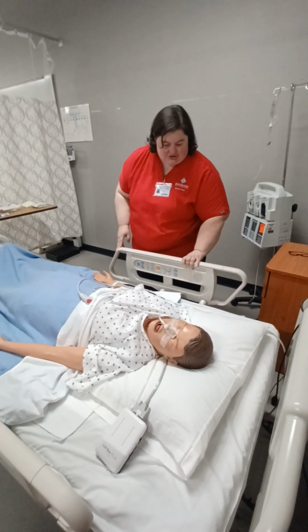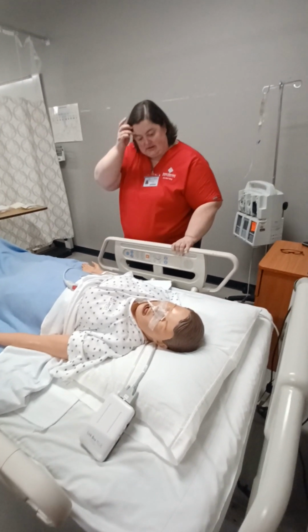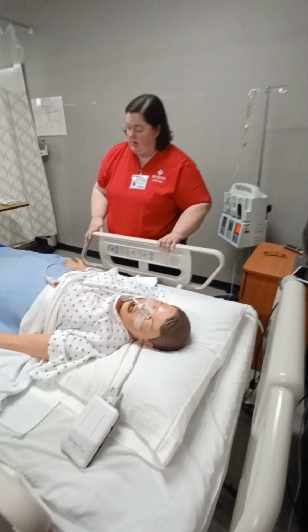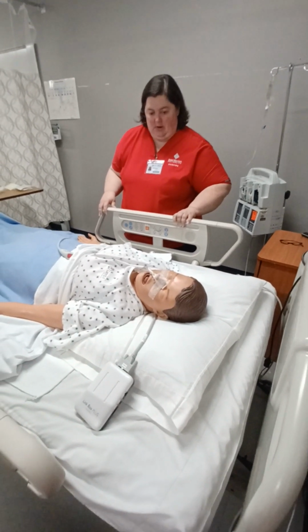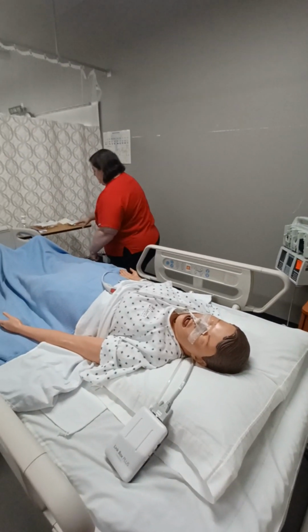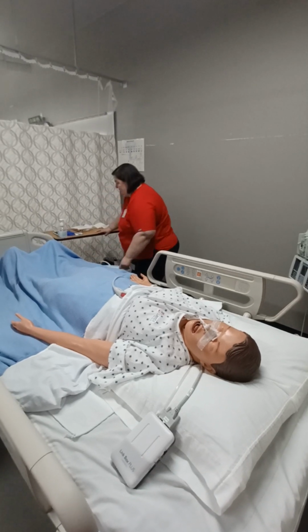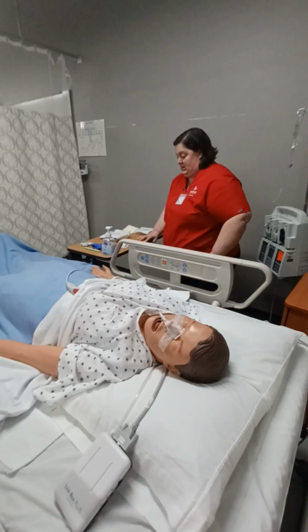You've had this dressing changed previously, correct? Okay, and that time went okay? Any pain or discomfort during that dressing change? Okay, and you do consent to us changing it for you again right now? Perfect. All right. So I'm just going to bring my table and garbage can over within arm's reach.